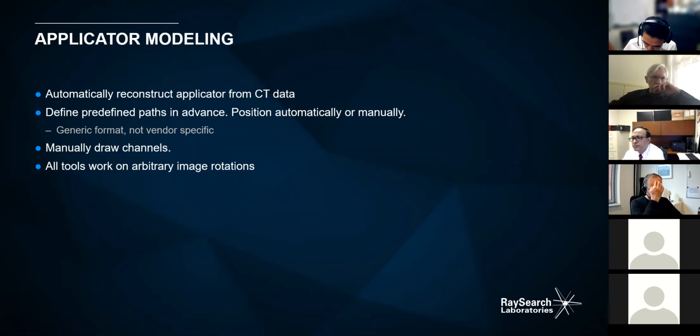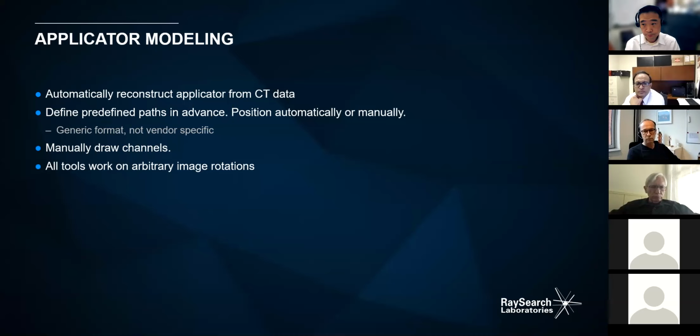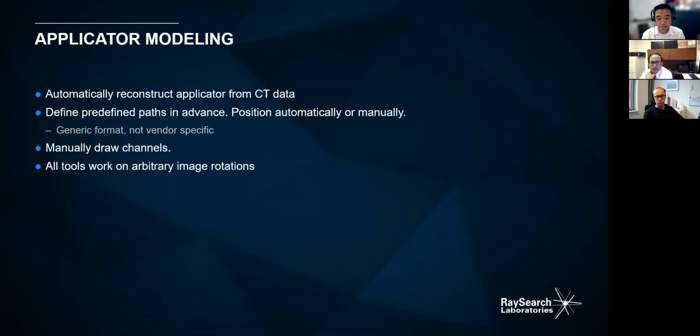describe those applicators, neither the composition of those. So just a heads up on how you can allow users to bring these files in. You might want to negotiate that with the makers of these applicators. And another related question I have, since you are mentioning the CT image: how about MRI? Can we use MRI for planning?